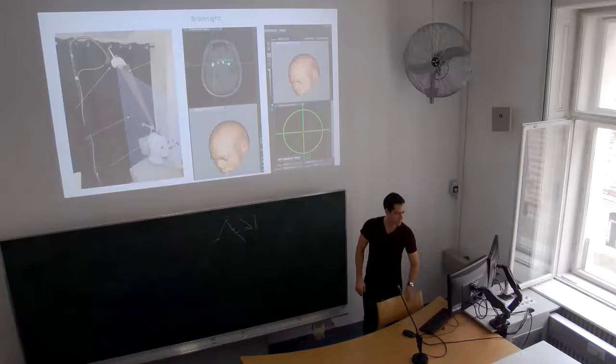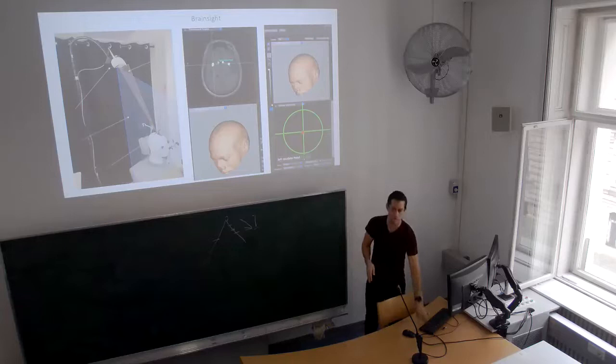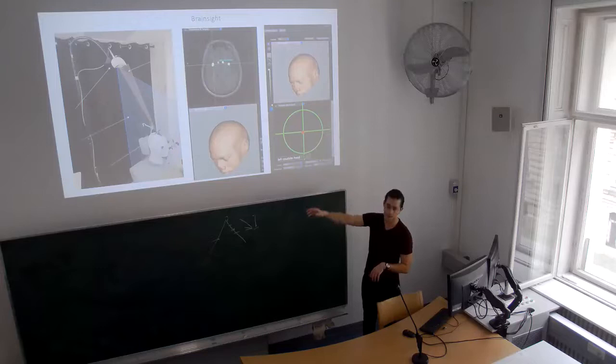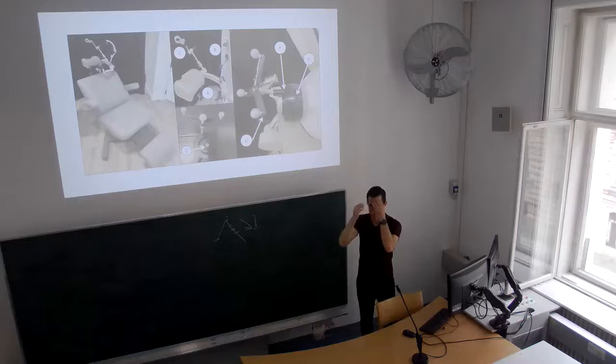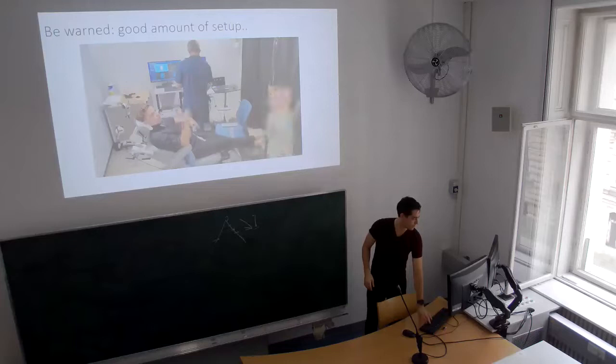Again, this can be a really precise thing. We'll talk about the dimensions of the focal point, but because of that, you need to use a good system for targeting because you want to be as precise as you can be. So often we'll use a neuronavigation system like this. This is a BrainSight, and you guys have one of those here. It's created for TMS, but we modified it for ultrasound. It looks like that. You might strap a subject to the chair and then use fiducials, registering their head to an MRI of theirs, and registering the transducer. And then in real time, you can target even very small nuclei or parts of nuclei.